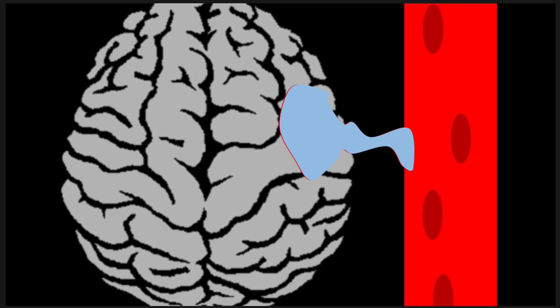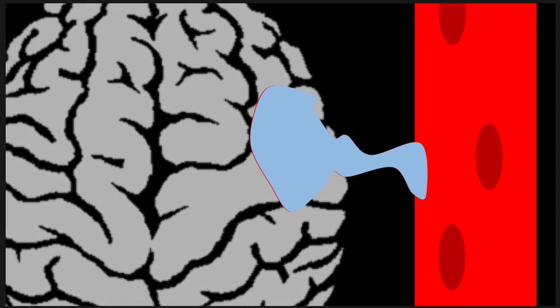Well, it's not quite water, right? But like I said, there's other stuff floating in there. But I start my brain thinking about it like it's water-ish. A little bit on the T2 bright end, a little bit on the T1 darker end. It's not dark, but it's ISO on the darker end.